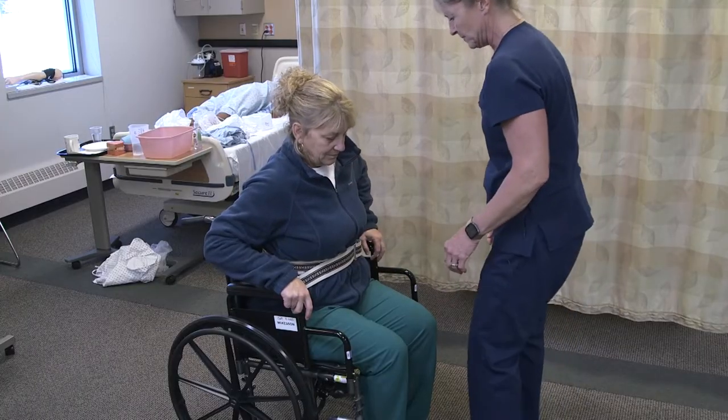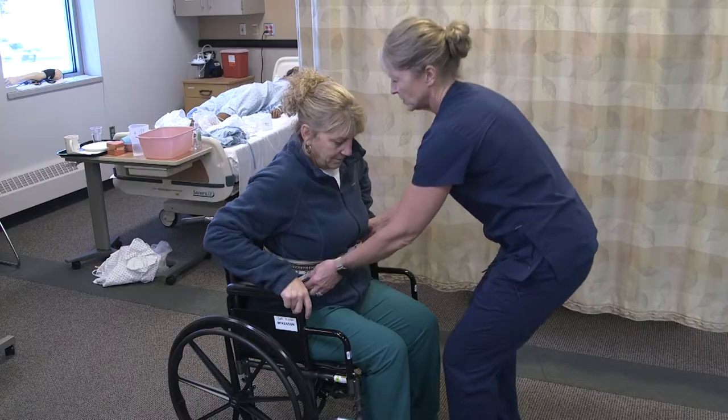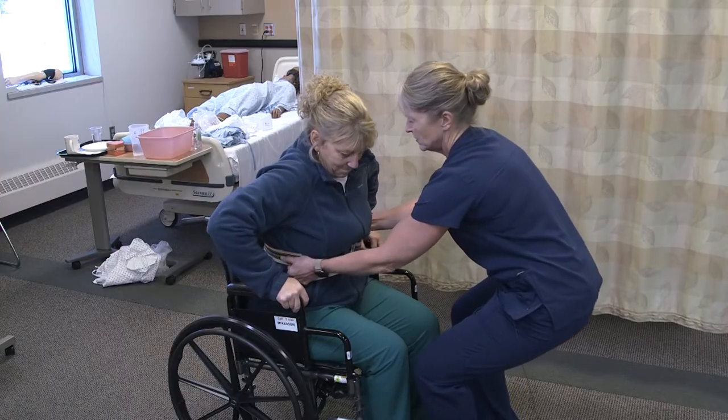I'm going to block her feet and make sure she doesn't go forward. On three, I'm going to have you push up on your wheelchair. One, two, three.